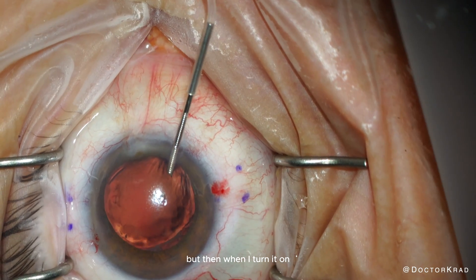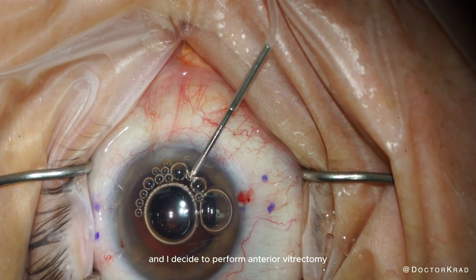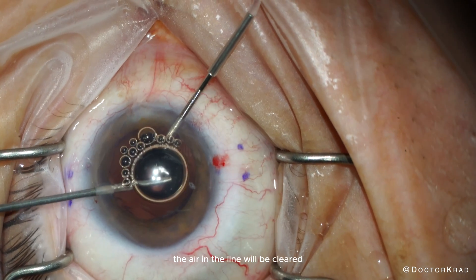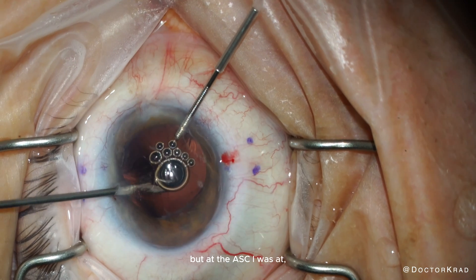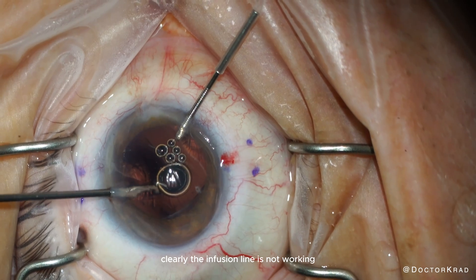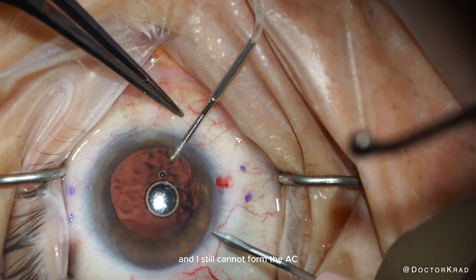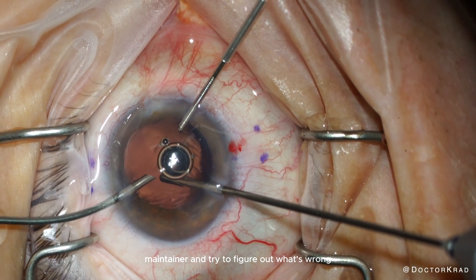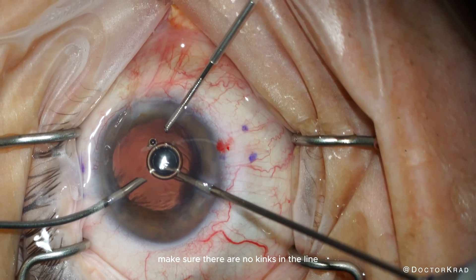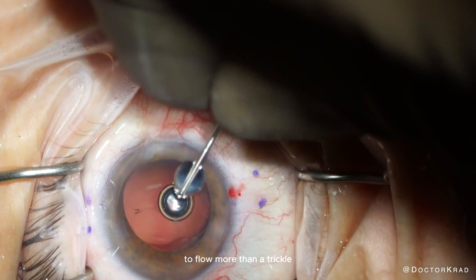But when I turn it on, I notice a problem with the infusion. I attribute this to some air in the line and decide to perform anterior vitrectomy, thinking the air will clear as it aspirates. I generally prefer a 23-gauge AC maintainer, but at the ASC I was at, they only had a 25-gauge. During anterior vitrectomy, clearly the infusion line is not working — there is collapse of the anterior chamber. I turn up the infusion as high as the machine will go and still cannot form the AC. Despite checking for kinks and forcefully flushing with a syringe of BSS, I can't get the flow above a trickle.